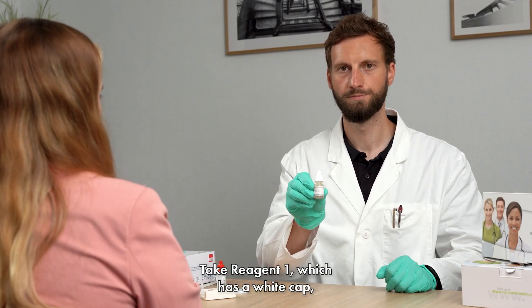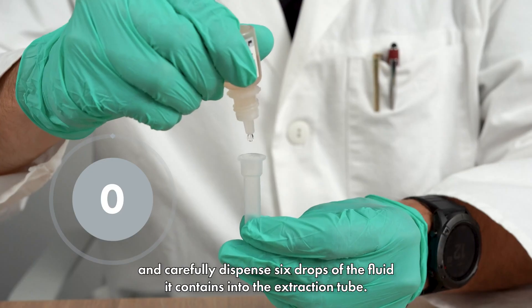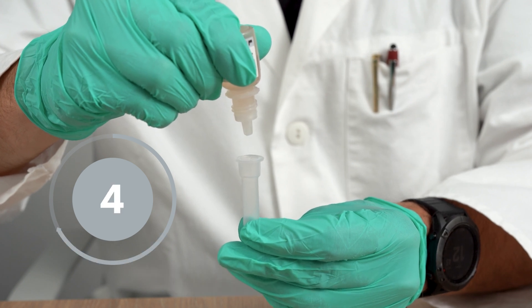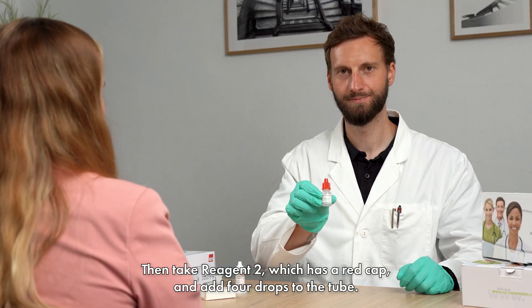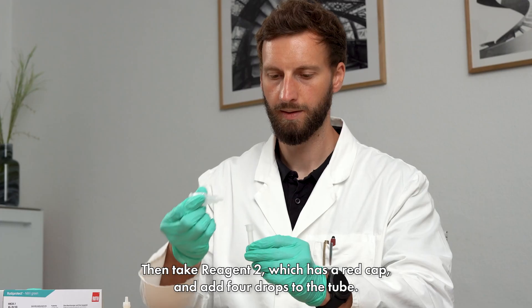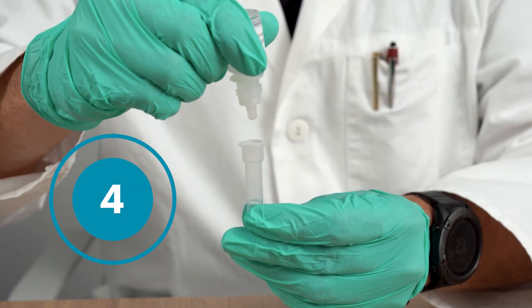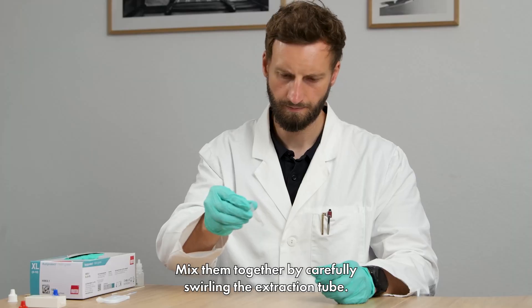Take reagent 1, which has a white cap, and carefully dispense 6 drops of the fluid it contains into the extraction tube. Then take reagent 2, which has a red cap, and add 4 drops to the tube.